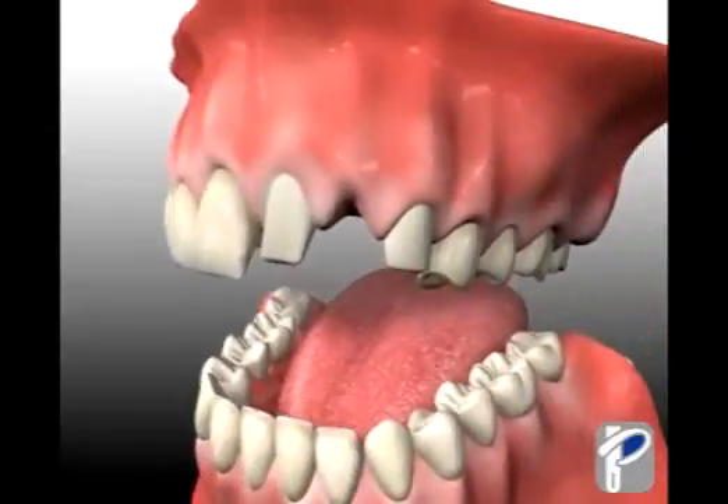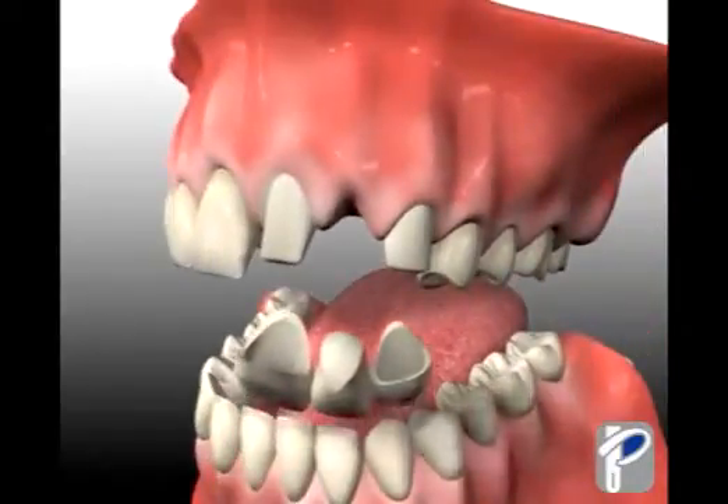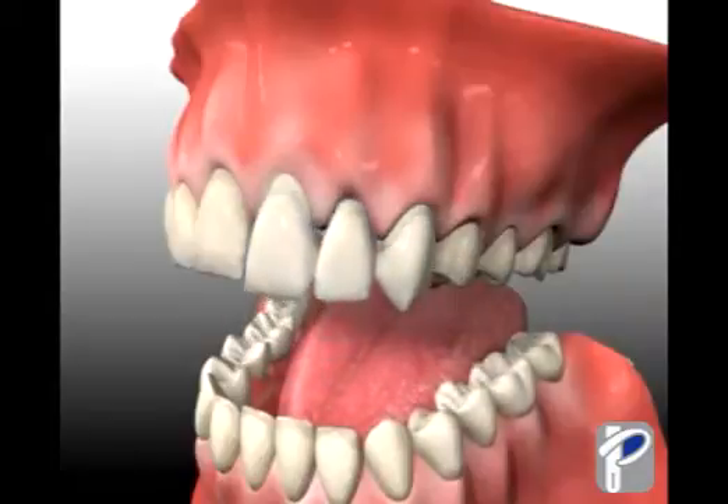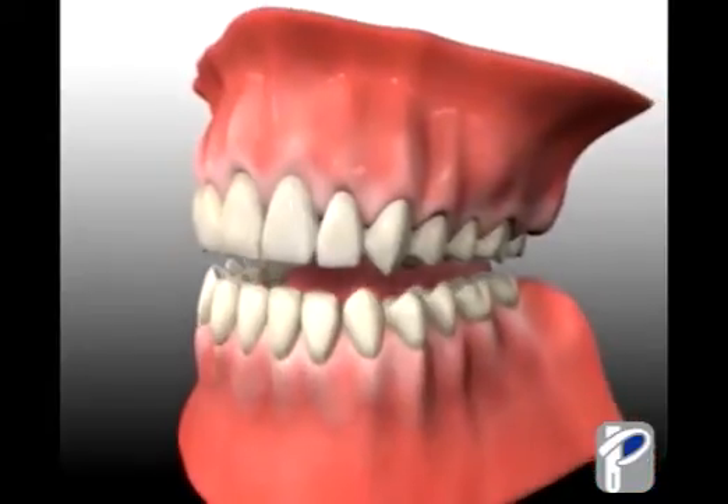Typically, a bridge will last for seven to ten years. After the teeth are prepped, the metal-free Procera bridge then gets cemented to these two prepared teeth and looks just like your natural teeth.